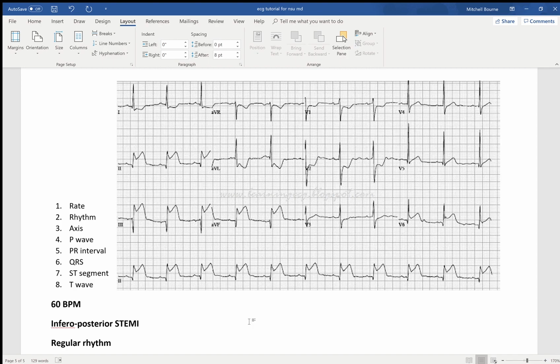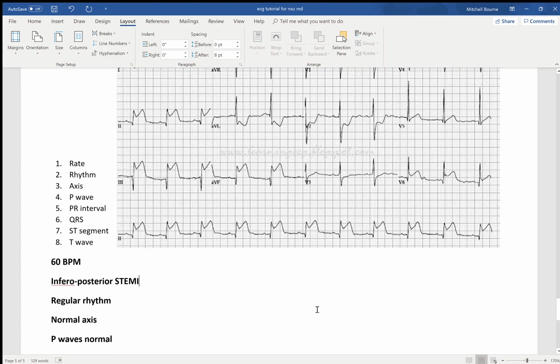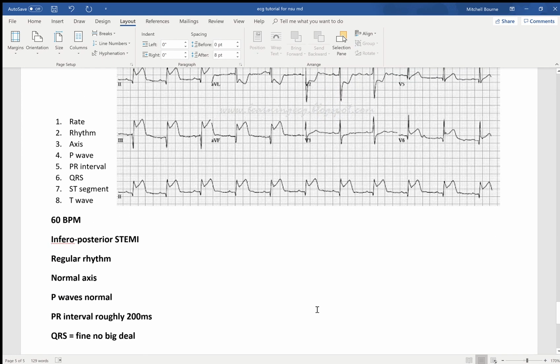Most people are right dominant, which means the posterior portion of the heart, or most of it, is supplied by the right coronary. Some people are left dominant, so they probably wouldn't have these changes. But we're kind of going a little bit too much into it, and we're sure we're going to cover this and a lot more tomorrow.